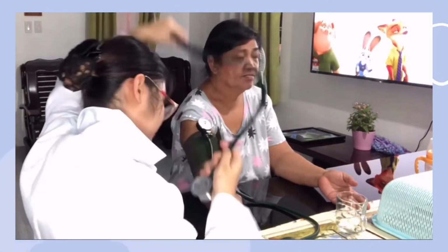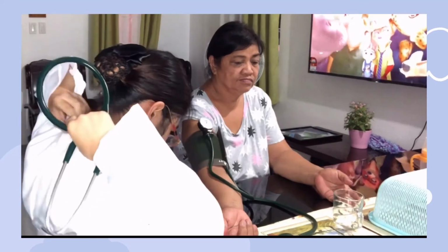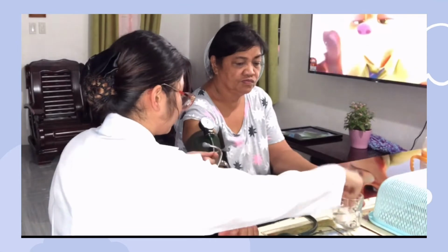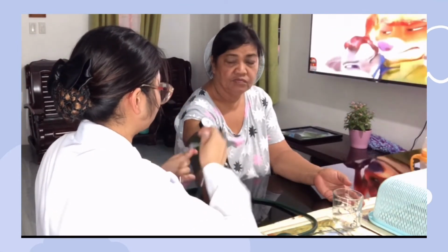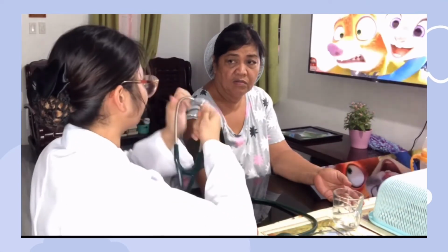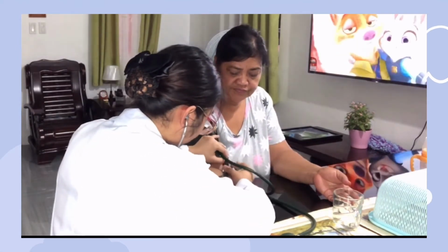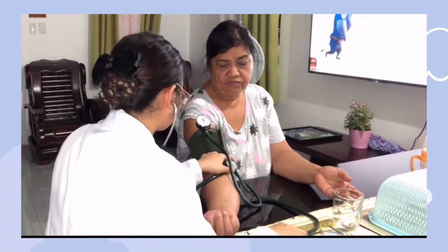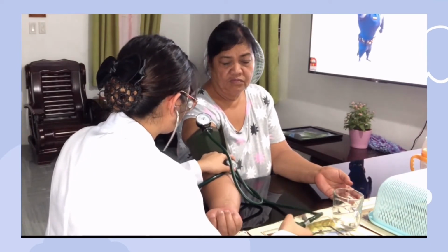Position the stethoscope appropriately. Cleanse the earpiece with alcohol or recommended disinfectant. Insert the ear attachment of the stethoscope in your ears so that they tilt slightly forward. Ensure that the stethoscope hangs freely from the ears to the diaphragm. Place the bell side of the amplifier of the stethoscope over the brachial pulse. Hold the diaphragm with the thumb and index finger. And then you're going to auscultate the client's blood pressure.